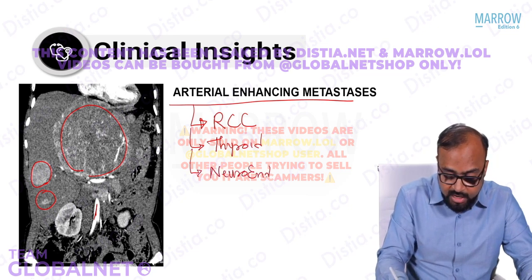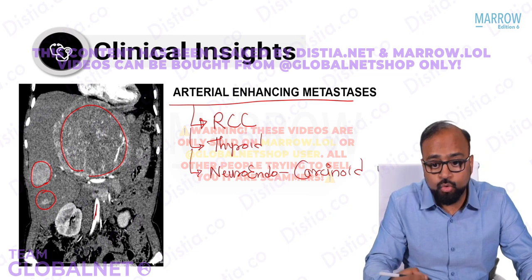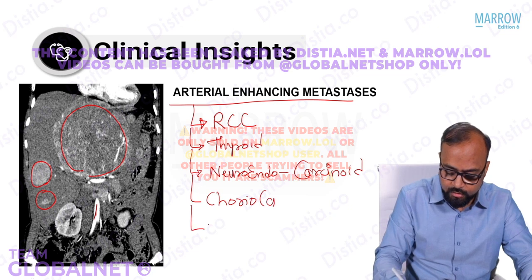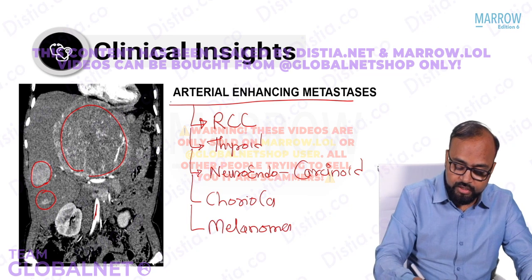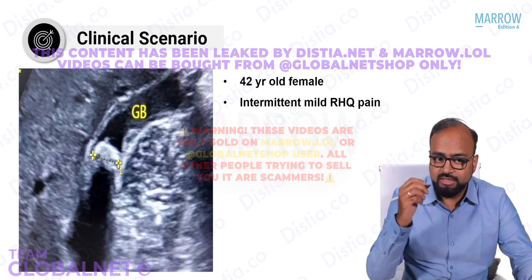Neuroendocrine tumors like carcinoid tumors. They can arise from choriocarcinoma, melanoma. So these could be the primary tumors when you see arterial enhancing metastasis within the liver parenchyma. Yes. Now look at this clinical scenario.